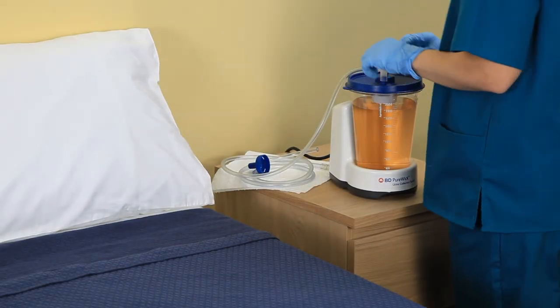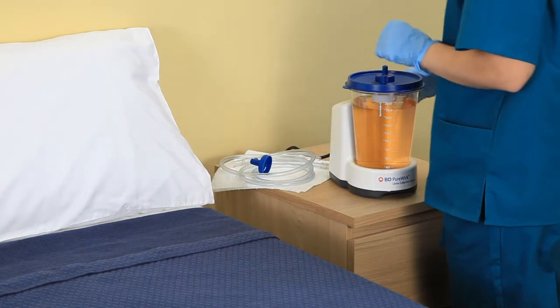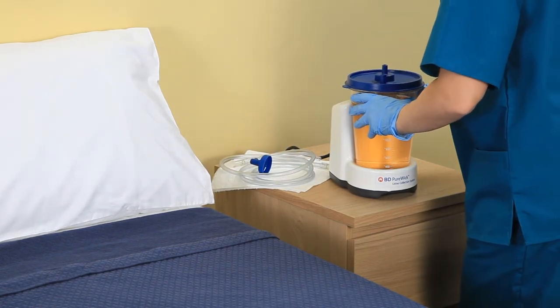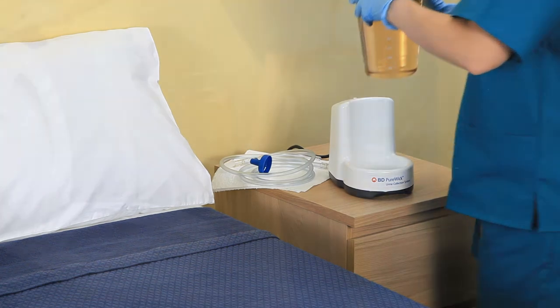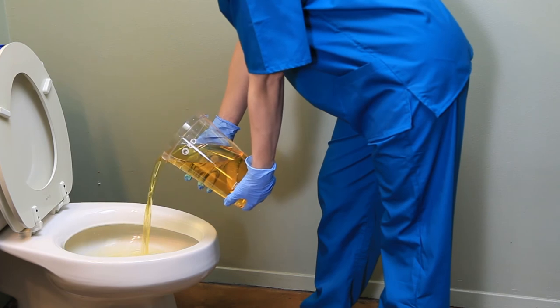Disconnect collector tubing and pump tubing from the canister. Lift the collection canister from the Purewick urine collection system. Do not lift the canister by the lid. Take the canister into an area appropriate for disposal.